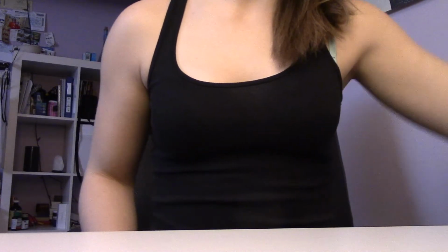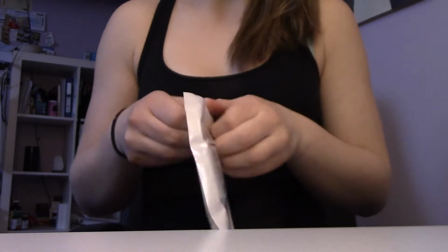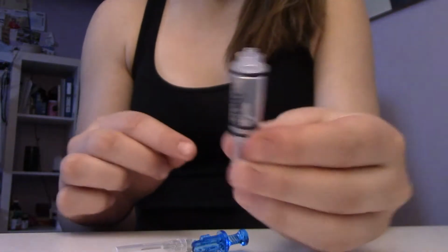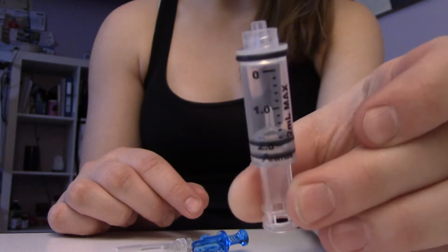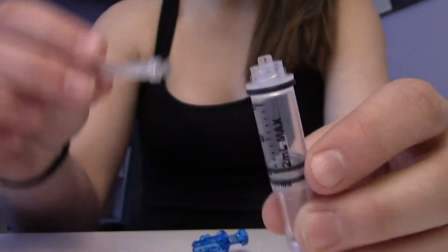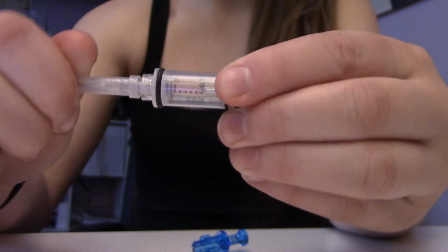Okay, so one of the first things you're going to want to do is get your cartridge filled. So that was this one here. All you're going to do is just open up the package. It's going to be a few different pieces that come out. So you're going to have this main part here. Just look like this. This is what's going to be storing the insulin. Then you're going to have the needle that you're going to use to pull the insulin out of the insulin container.